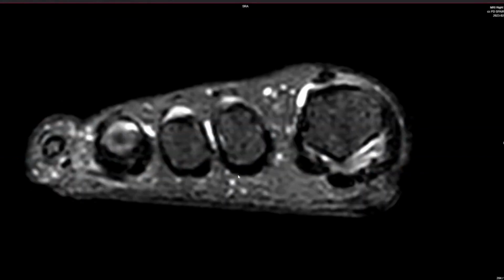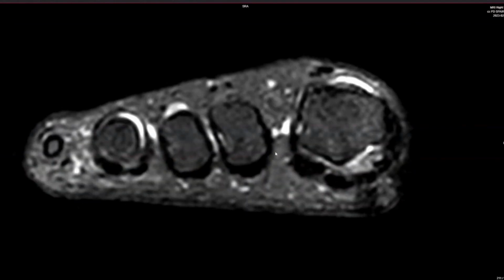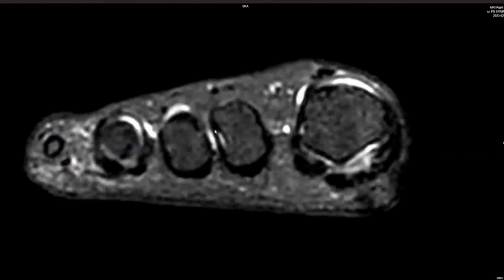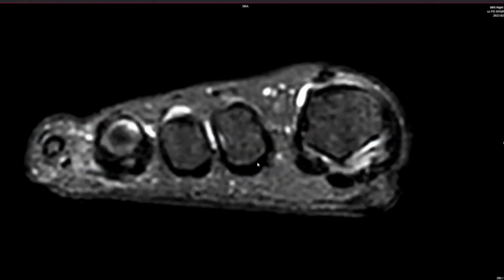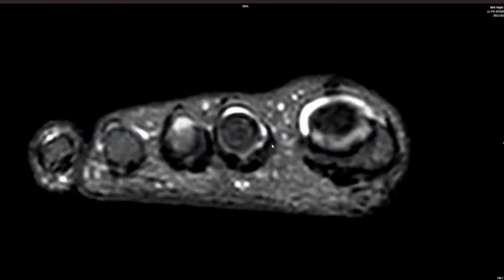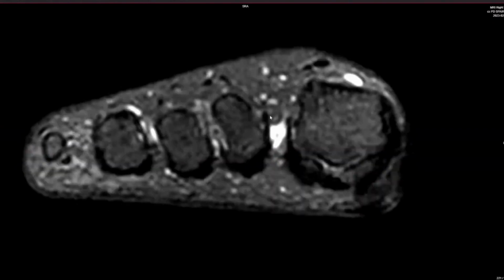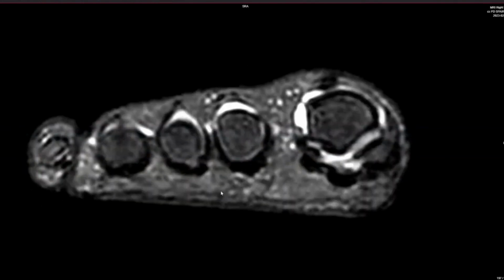So in the case of a normal plantar plate, again, what we'll be looking for is that U-shaped plantar structure, the plantar plate, blending imperceptibly with the flexor tendon. We'll be able to see the accessory and the proper collateral ligaments as a complete U-shaped structure supporting the MTP joint. We will begin to see reinforcements at the tibial side of the distal joint capsule, where the interosseous tendons of the dorsal and plantar interosseous musculature will join up and form reinforcements all along that medial side of the capsule. And that is your normal plantar plate imaging.